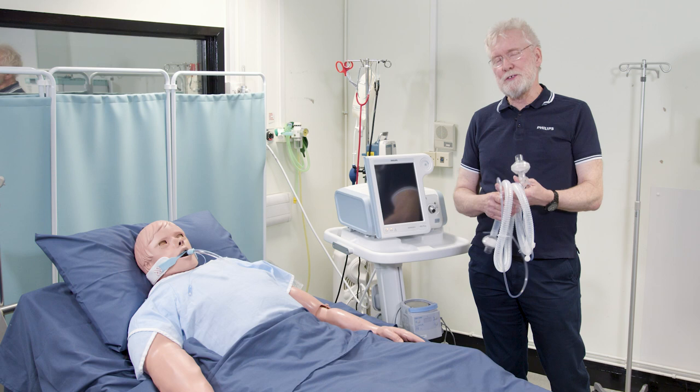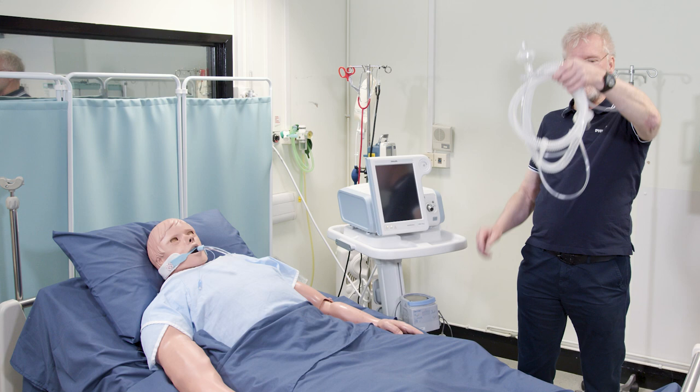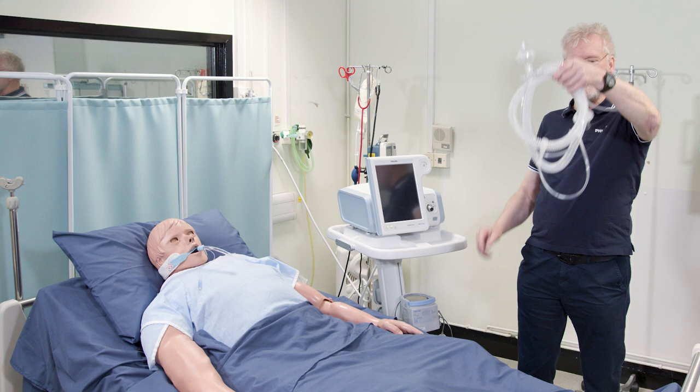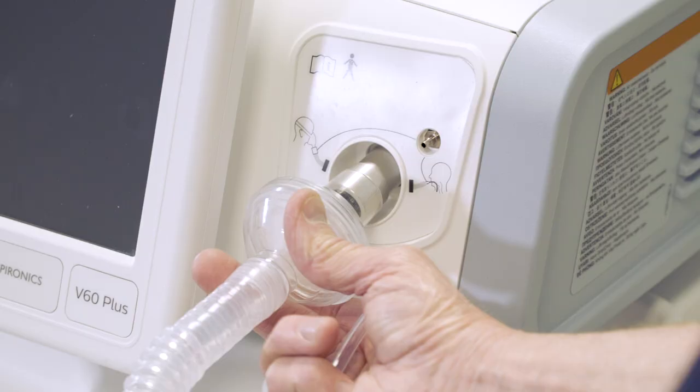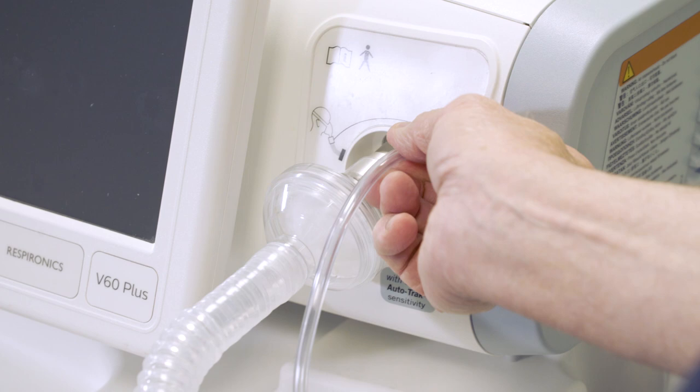This is a dry circuit for this device. It comes complete in a pack — all that you want is in there as one. It still has a bacterial viral filter that you put on the gas outlet, and it has a proximal pressure line that you will attach to here.